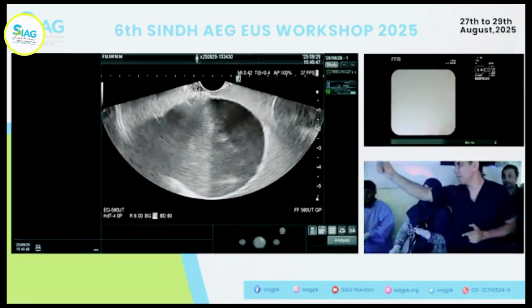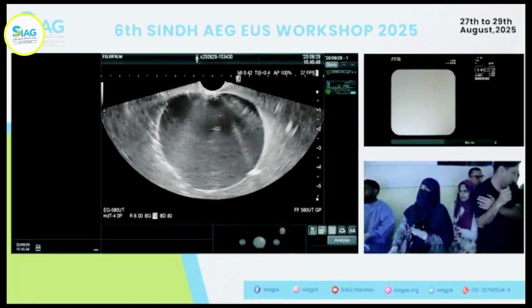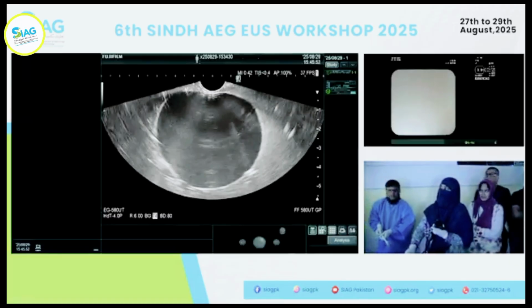This is excellent. How do you find this? Very good, sir. Huh?